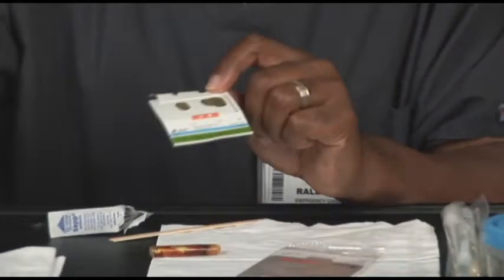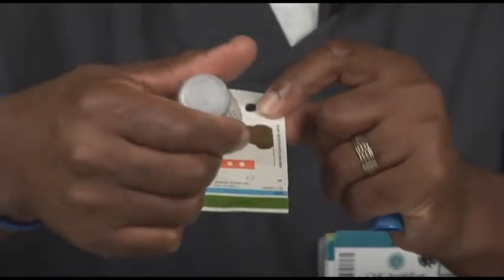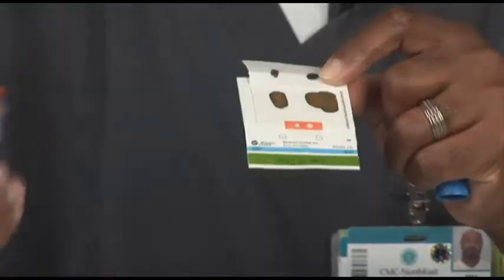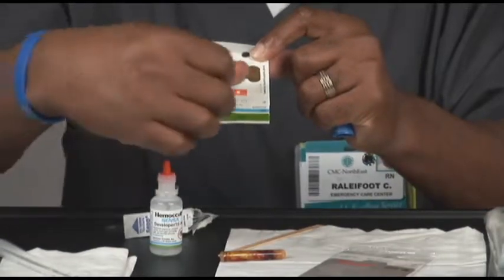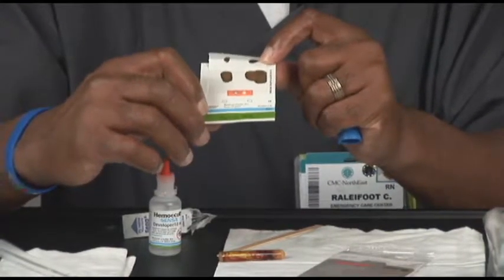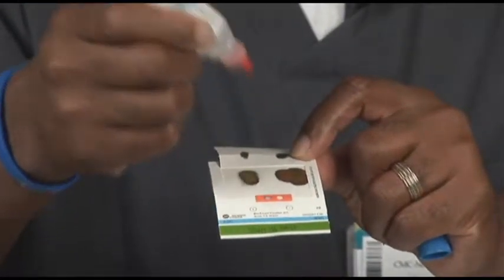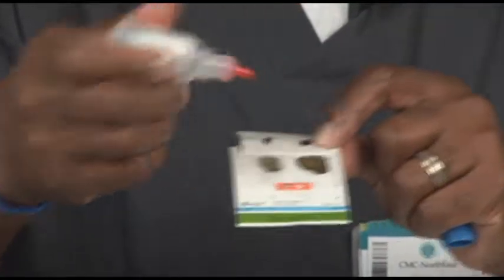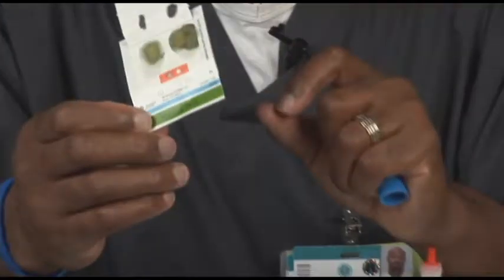You would have to apply the developer for the Hemocult, which has a blue cap on it. First you would put a drop of developer between the 2 dots on the orange control window. So you put your drop there. The positive control should turn blue, and the negative control, you won't have color change at all. And then you would place a drop of developer on your window, and if it is positive, you will get a color change, blue like that.